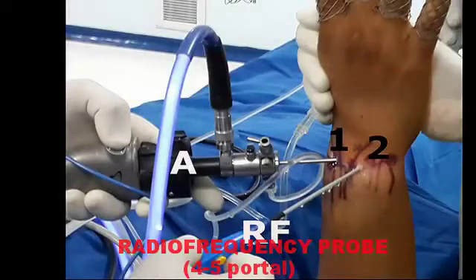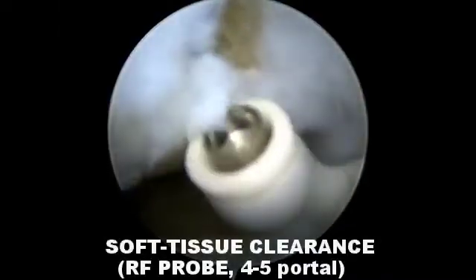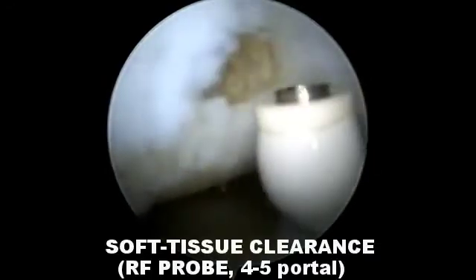A radiofrequency probe is used for soft tissue clearance around the lunate for adequate visualization of the drill hole.